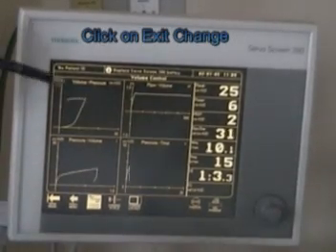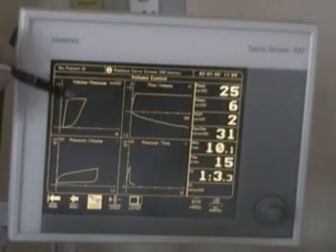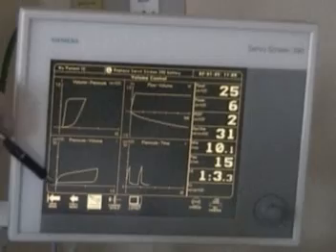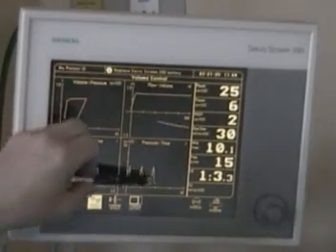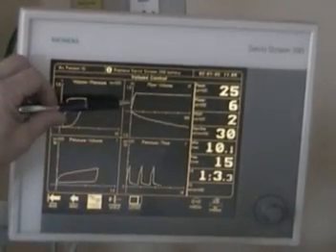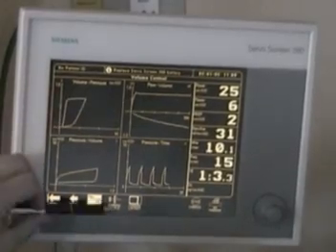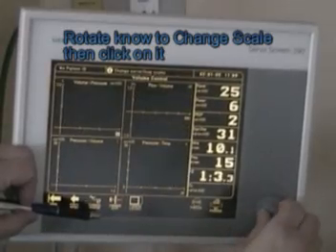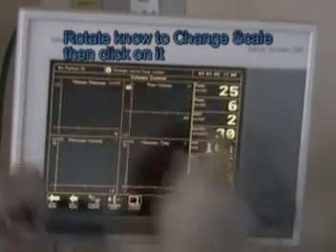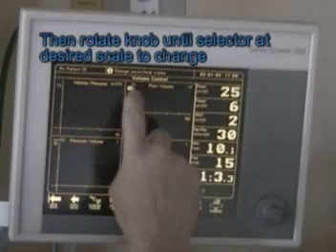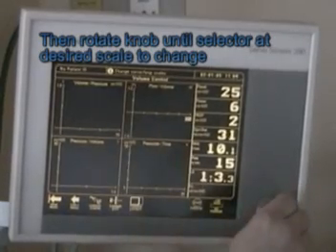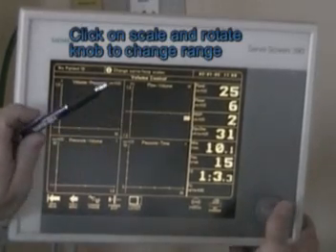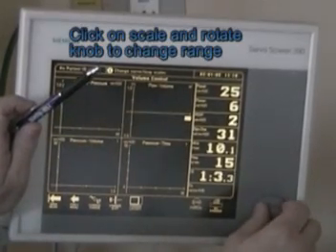This one is nicely shaped so you can see the whole loop here. We can see the waveforms pretty well, but this flow-volume loop is pretty big, so let's change the scale. We're going to rotate the knob to change the scale, rotating until we get here. The top of the loop wasn't the problem — it was the length of the loop.